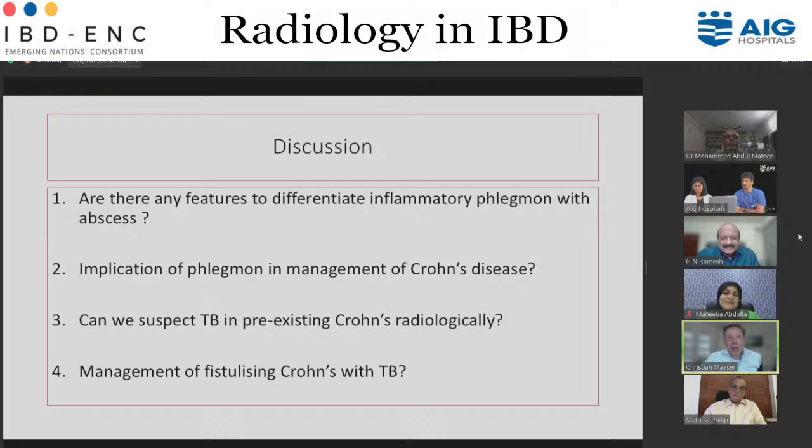On intestinal ultrasound, you can't clearly differentiate one from the other. It can just tell you there is an inflammation of the bowel. You can see the lymph nodes with the contrast media. You can differentiate inflammatory mass from abscess, but you cannot rule out TB. And again, you are much more the experts than I am.